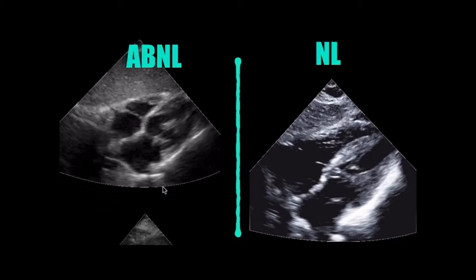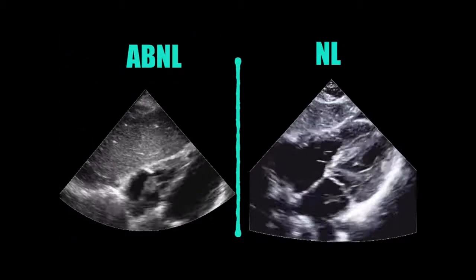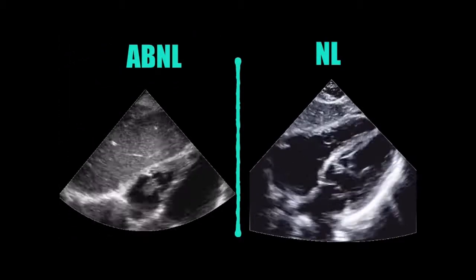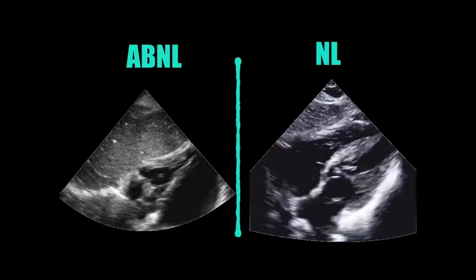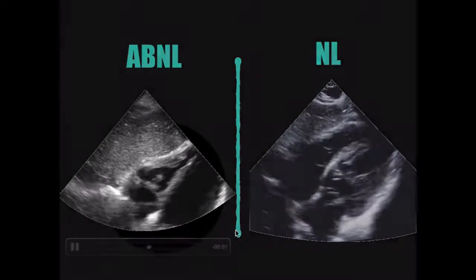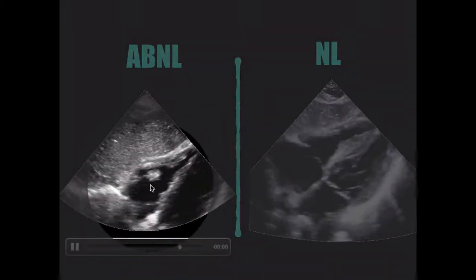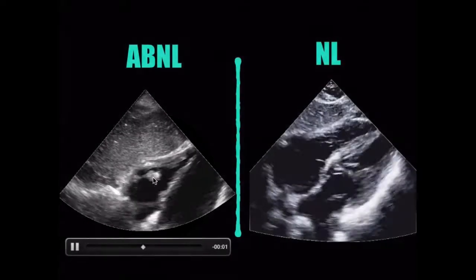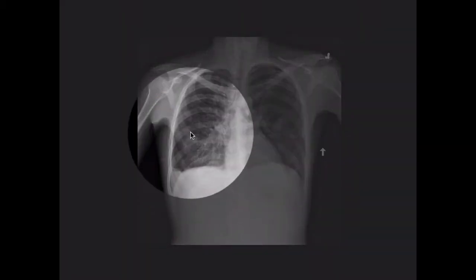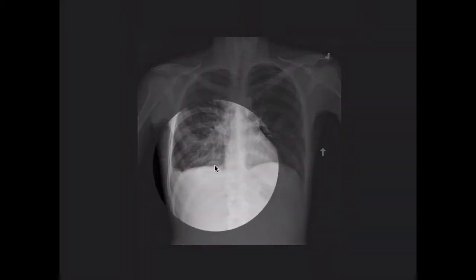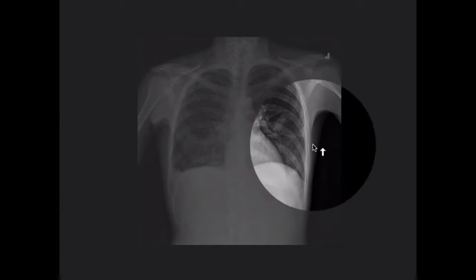There's another sub-xiphoid view. Which valve is it — tricuspid or mitral? Tricuspid, yeah. Right here, that's that little booger on the valve — this is tricuspid endocarditis. You can see those little white spots there, there, there — those are all septic emboli.